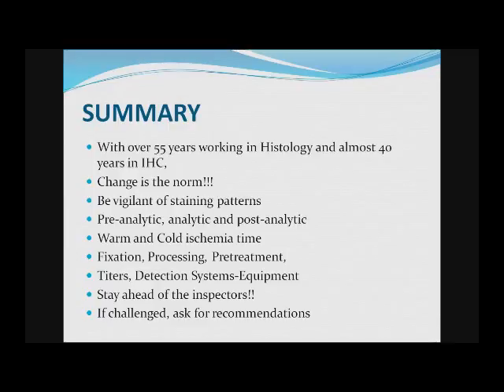Always consider your pre-analytic, your analytic, and your post-analytic conditions, and your warm and cold ischemia. They play a big role in your preservation of the antigens and the DNA and the RNA that we are looking at. The fixation and the processing, the pretreatment, the titers, the detection systems, the equipment that we use, the instrumentation we use, and make it your goal to stay ahead of the inspectors.